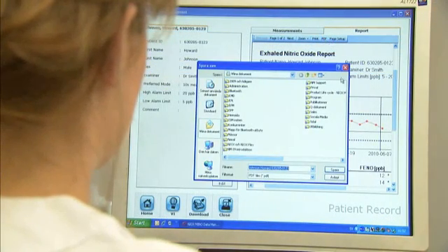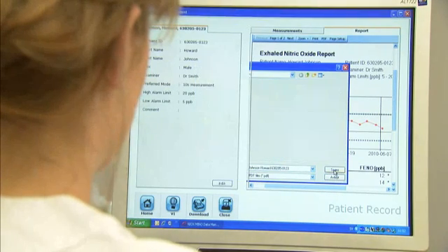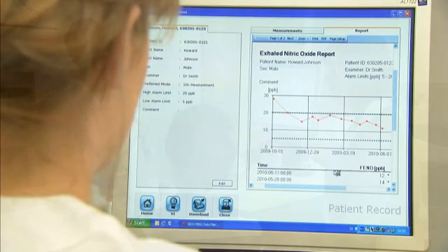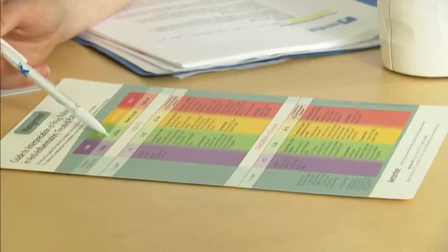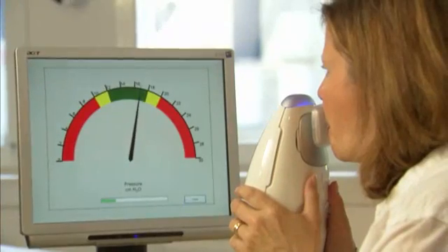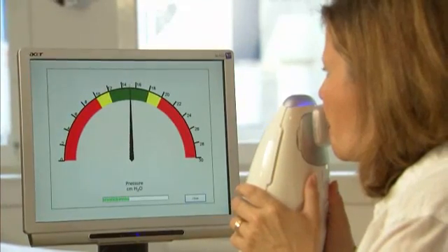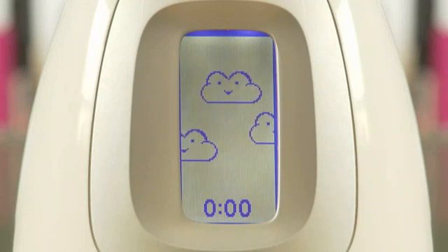The software is also prepared for direct communication to patient electronic medical record systems. An algorithm helps interpret test results. With NIOX MINO you get accurate and quality assured test results time after time — this is the easiest way for following airway inflammation.